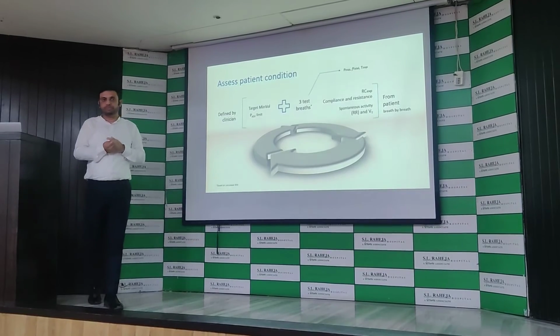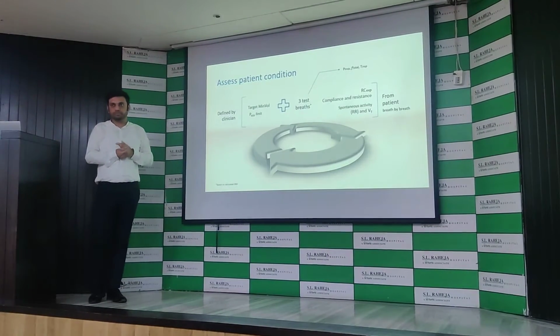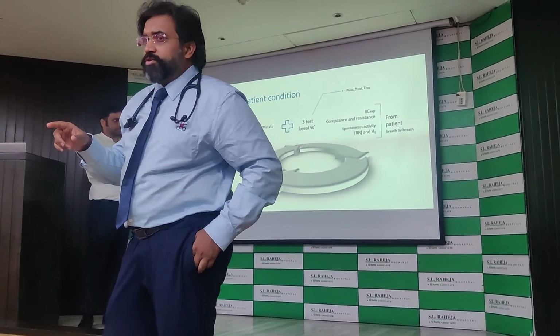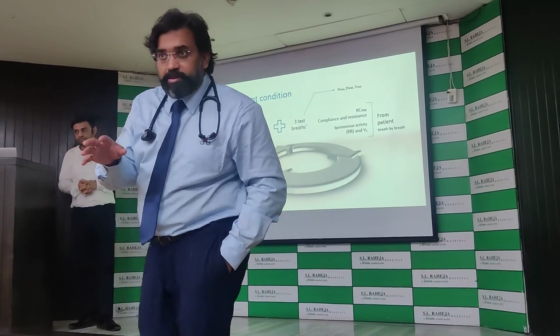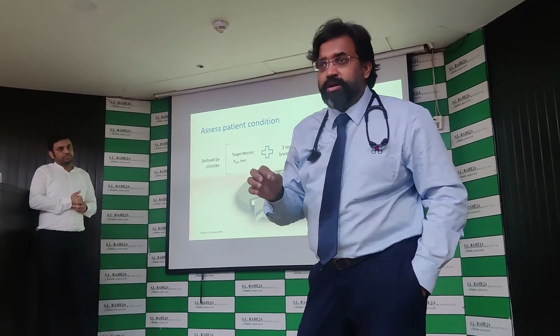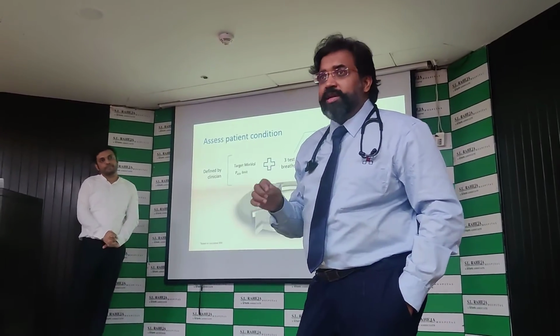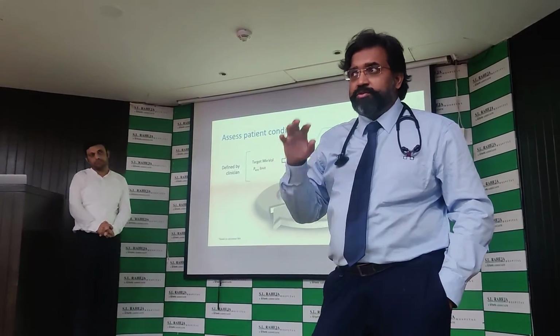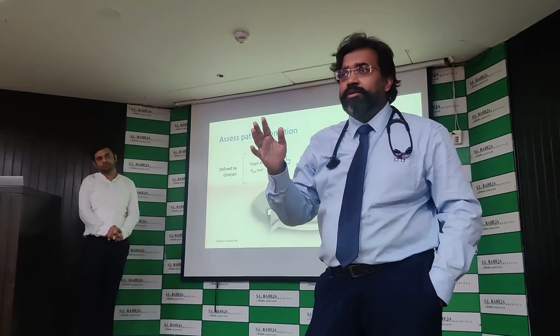I don't know, there is another ventilator setting called PRVC on the ventilator, pressure regulated volume control. All these work on the same principle. Whenever you do any measurement in the ICU, let it be ultrasound, compliance, or plateau, you always do 3 measurements, because the average of 3 measurements is what we actually look at to understand the measurement.